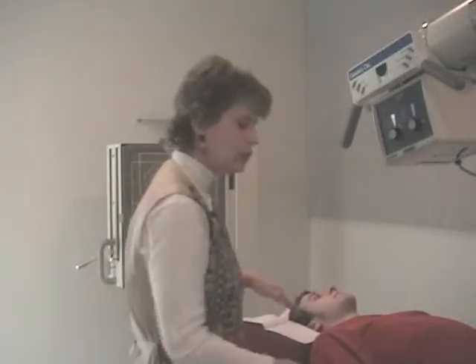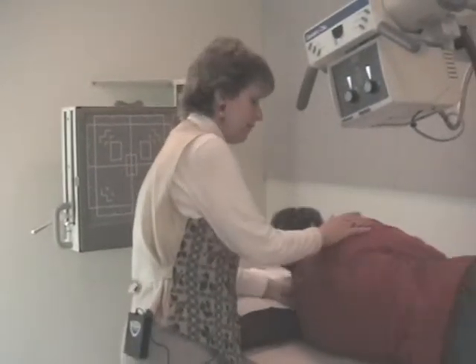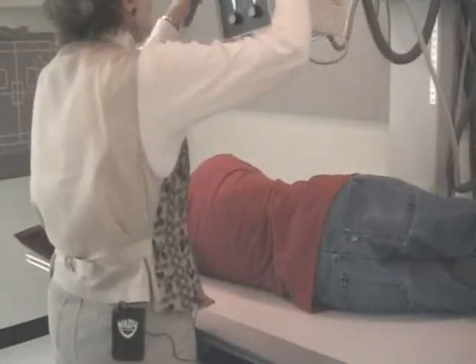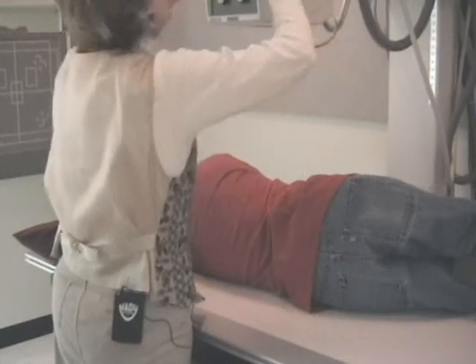We're going to turn the patient into a lateral position now, and I think I can talk while we do this, and we can save some explanation. Have the patient face away from you. Put a sponge between their knees for comfort. Get them straight on the table. You want a perpendicular beam, 40 inches to the bucky.